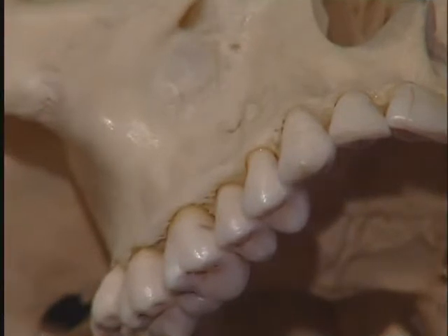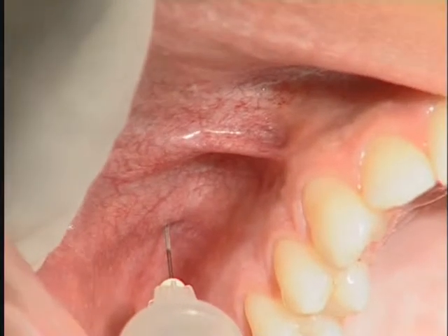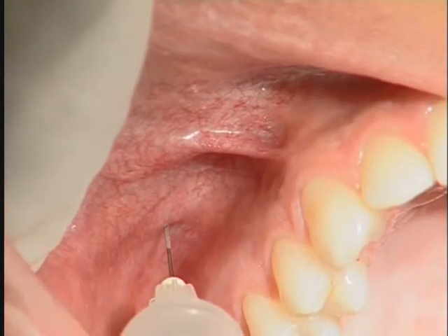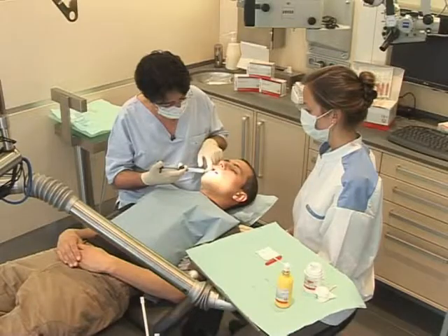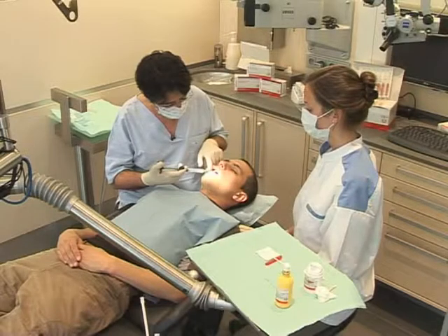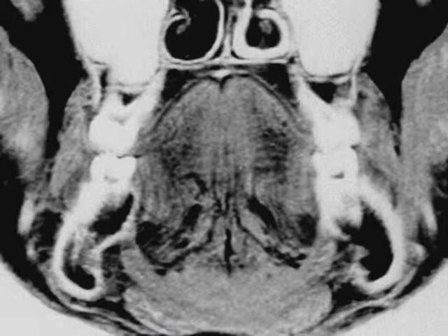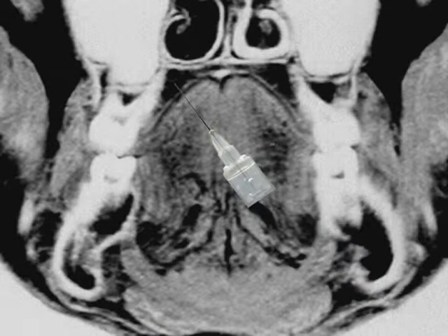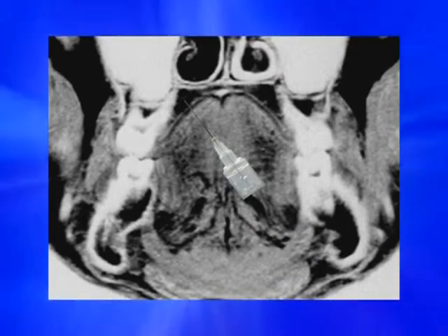As the middle superior alveolar nerve supplies the mesial buccal root of the first molar in about 25% of cases, a further anesthetic procedure in front of the zygomatic process is sometimes needed. Similarly, if root divergence has meant that the sinus is located between the buccal and palatine roots, an additional palatine injection facing the apex will be needed. The solution will diffuse through the vascular channels of the hard palate.